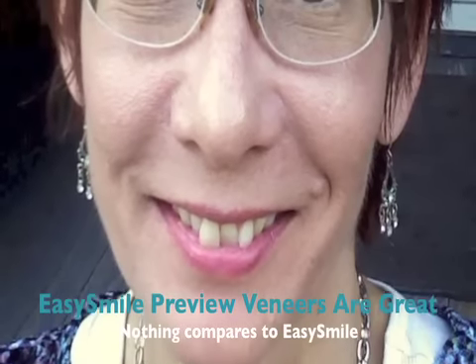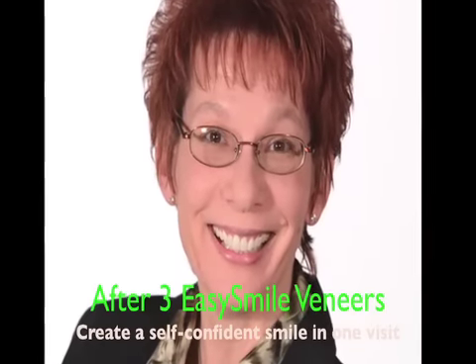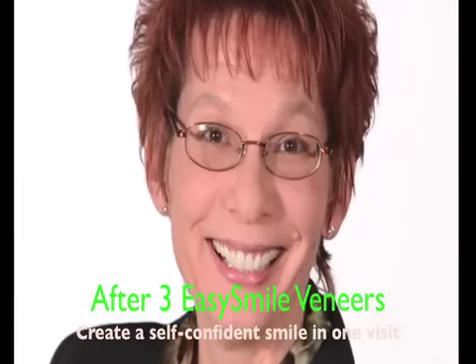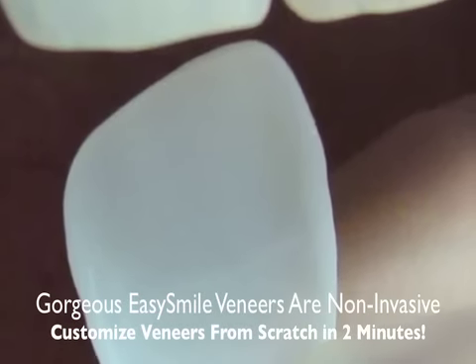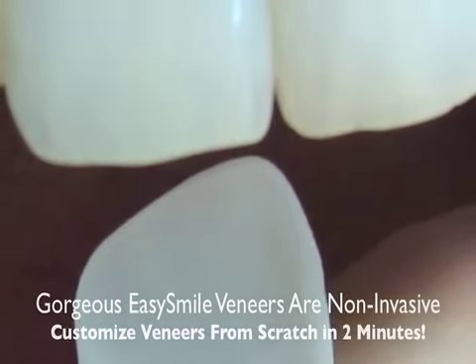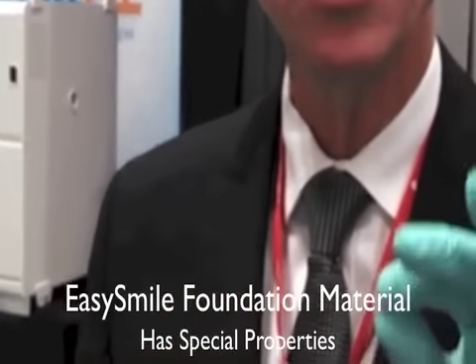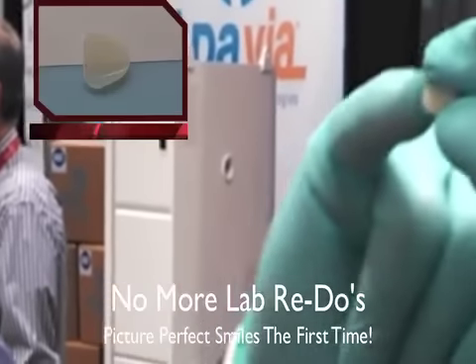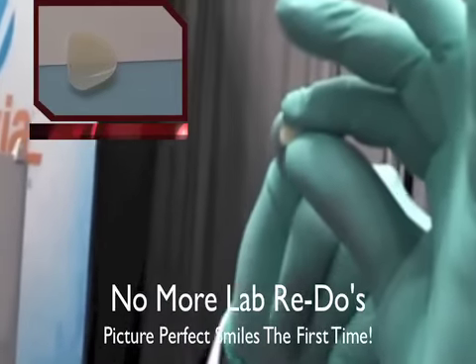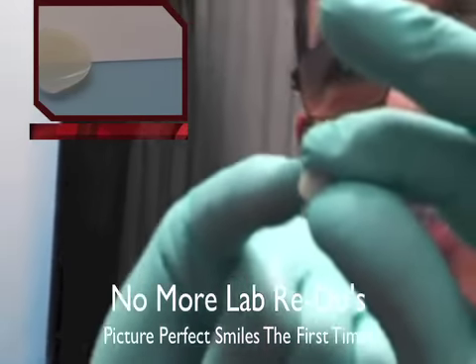Think about it this way: you've customized your own preformed veneer. Now you've got a preformed veneer that is exactly solving that particular patient's problem, and all you have to do is cement it when you're done. Look at how natural, how translucent this is — you can see the glove finger through it.